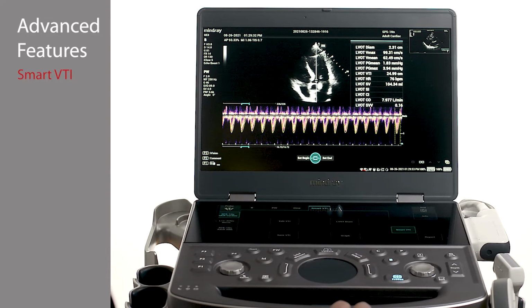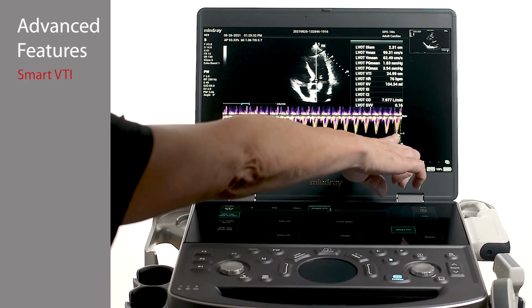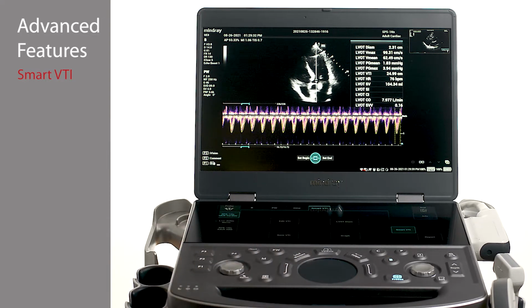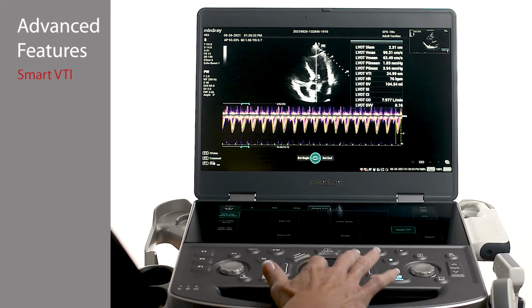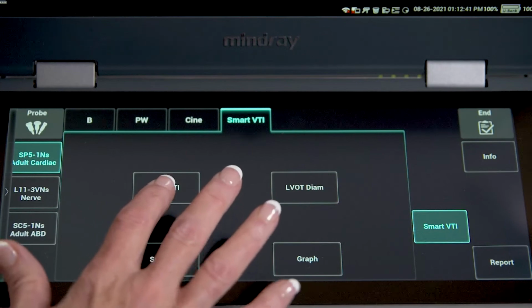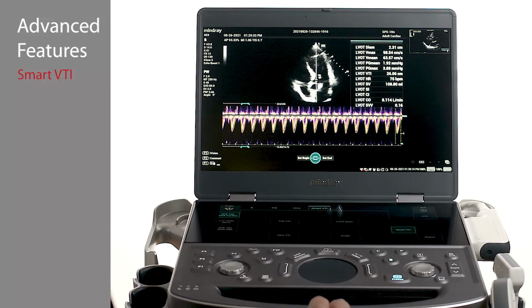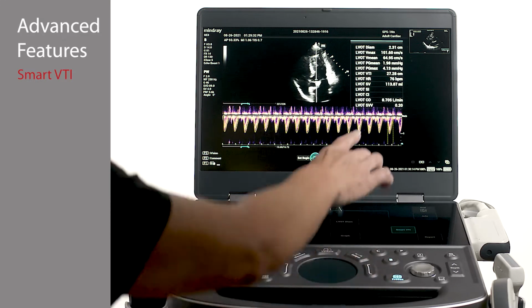The Doppler envelope being used for the displayed data is the last one to the right. It is indicated with dotted lines. Scroll to a different complex if this one is suboptimal, or manually adjust the trace with the Edit VTI tab using the caliper and touchpad. Data will change as soon as a different complex is chosen or there is a change to the tracing contour.